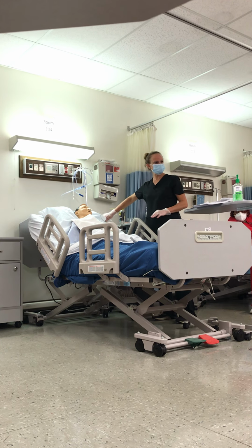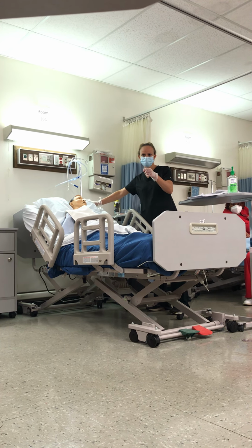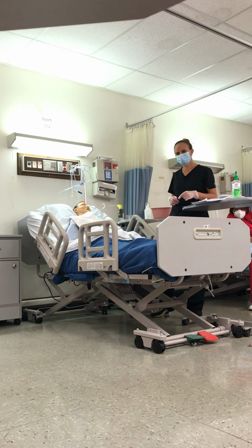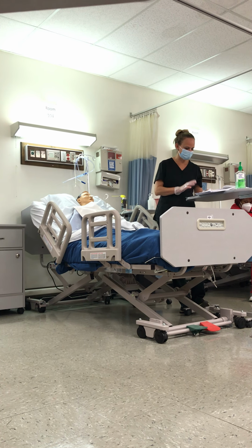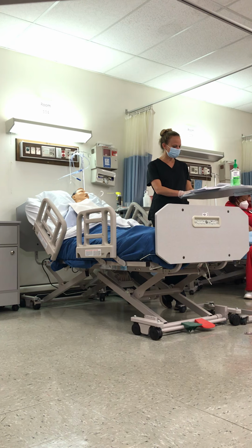So a lot of times you see these taped to the bed up here, right? A lot of times they're transport patients that have them. They're normally a lot smaller, the tube. Yeah, there's a little bitty one. Are they normally taped to the bed up here? Yes. Okay. Sometimes I didn't know.